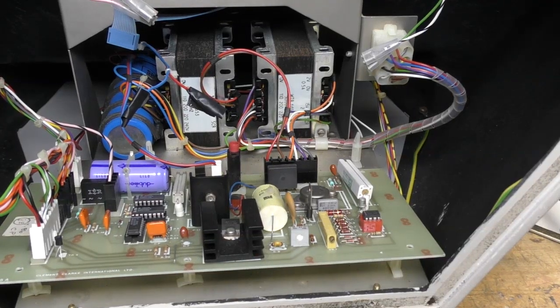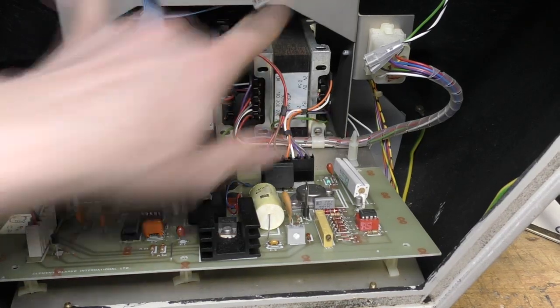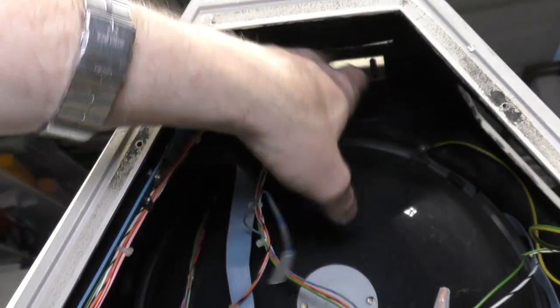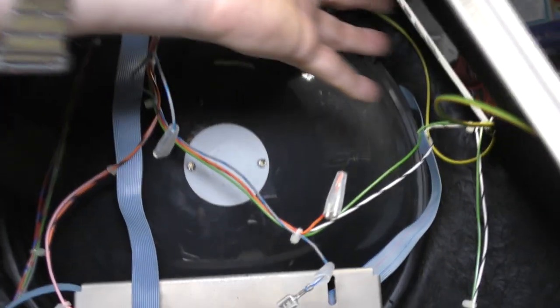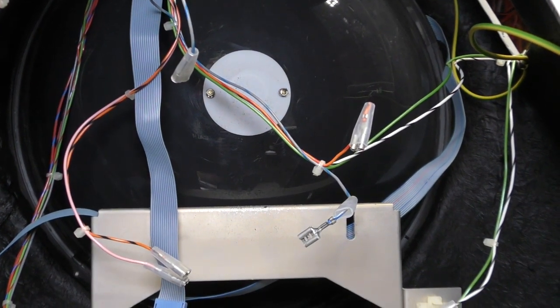As I say, this is actually a real pain to get apart because of that optical assembly. You've got two screws here to get at it, but the other screws are up in here on this bracket, so you need to get a screwdriver to this one side and then a spanner from this window on the side to get the non-captive nuts at the side to get it off.